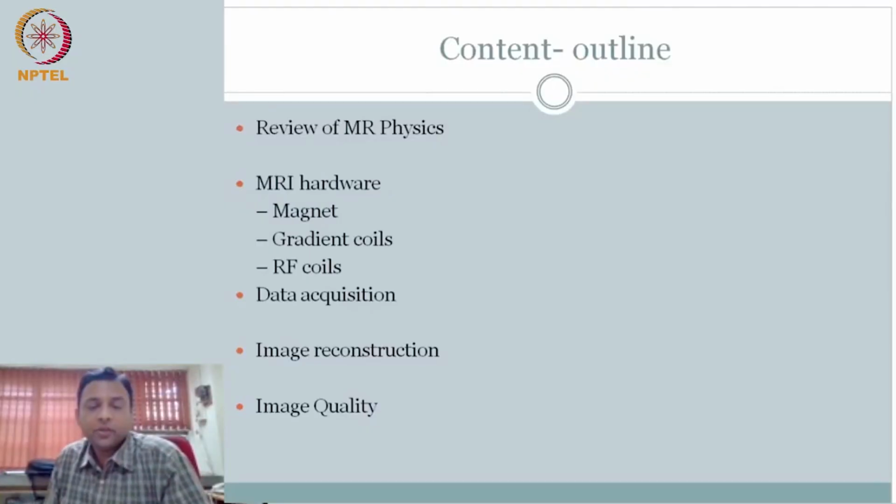Okay, so I guess you had a chance to view and appreciate the beauty of MRI recording, right? The data that we got, and why is it that the data that you're recording, unlike other modalities, is actually the Fourier transform. Even though the signal is represented as S of t, the data that you're recording actually turns out to be samples of your Fourier spectra.